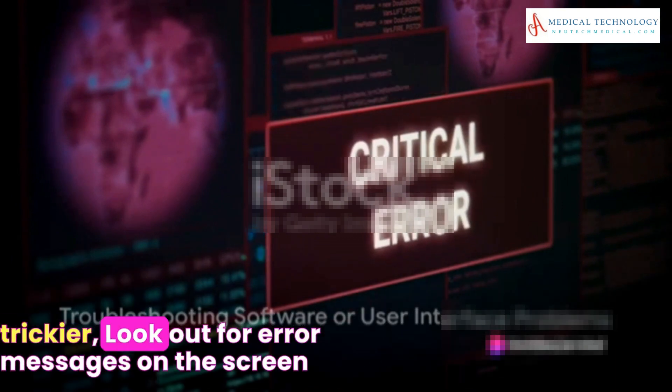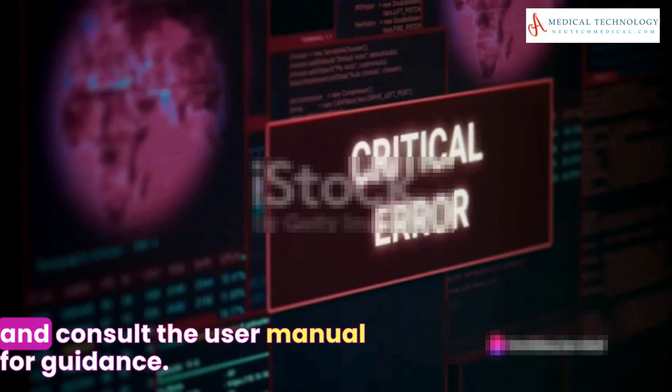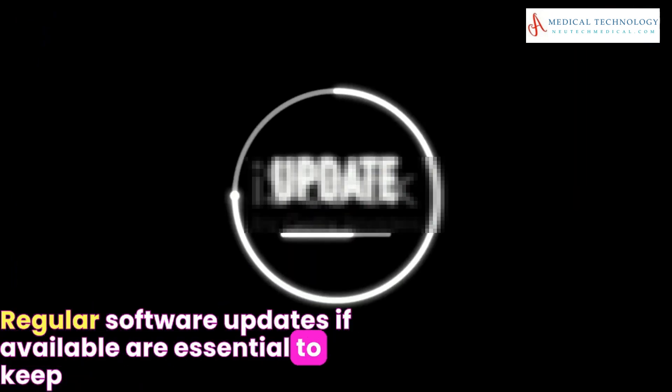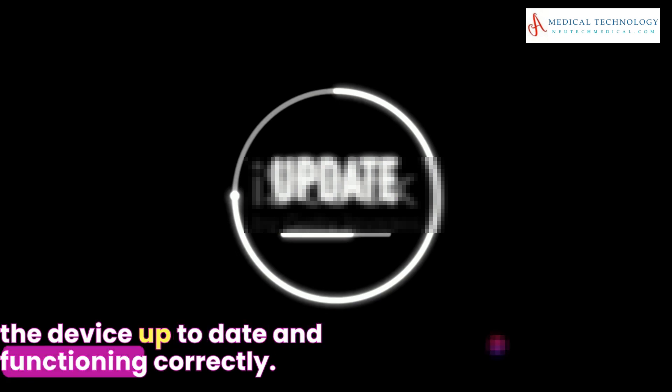Software or user interface problems can be a bit trickier. Look out for error messages on the screen and consult the user manual for guidance. Regular software updates, if available, are essential to keep the device up to date and functioning correctly.